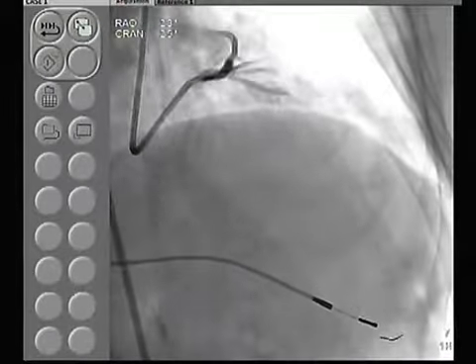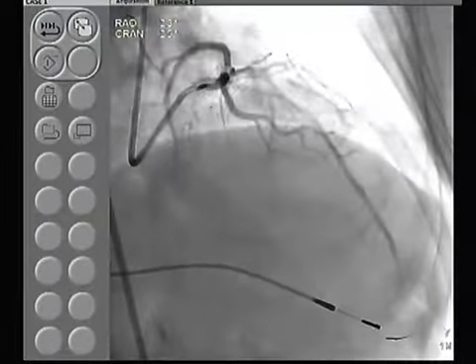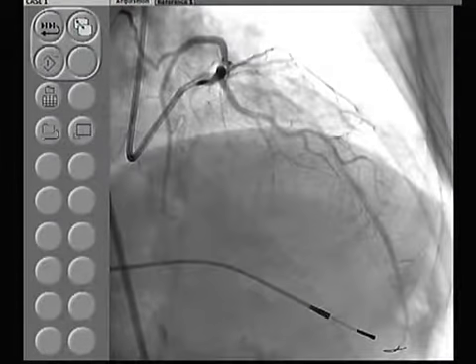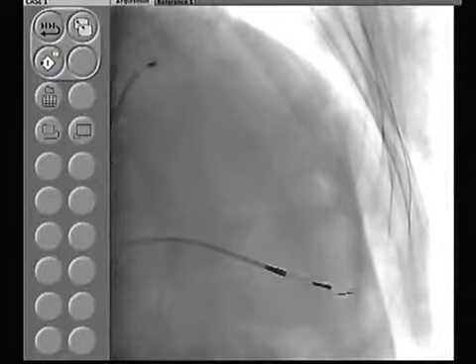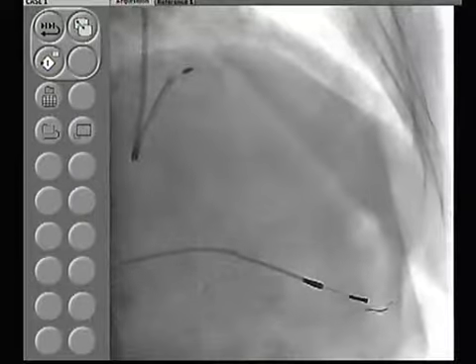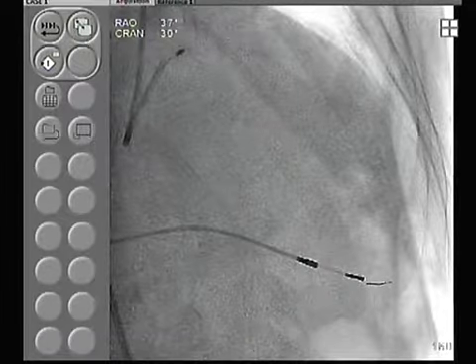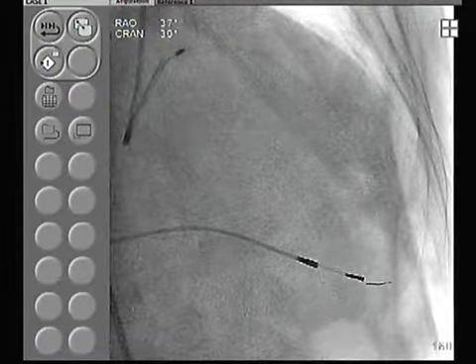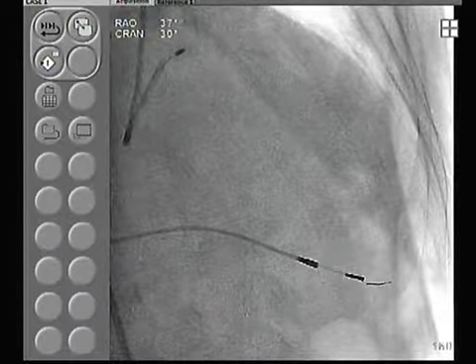Now, why did you decide for the LAD first as opposed to the right? Yeah, I think from the bifurcation and the angiographic point of view, we felt this patient had multi-vessel ischemia when he came in. So the disease was everywhere. That was the point. We wanted to know the tightest lesion has been taken care of, the OM. So we felt that LAD diagonal versus RCA, there are probably more learning points and technical challenges in this bifurcation lesion than the right coronary. But all will be done.